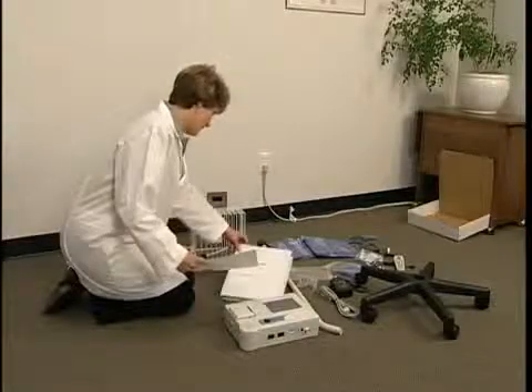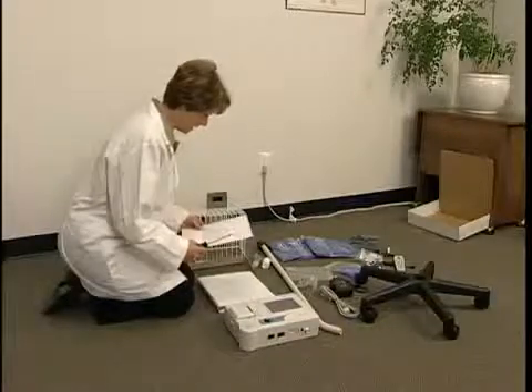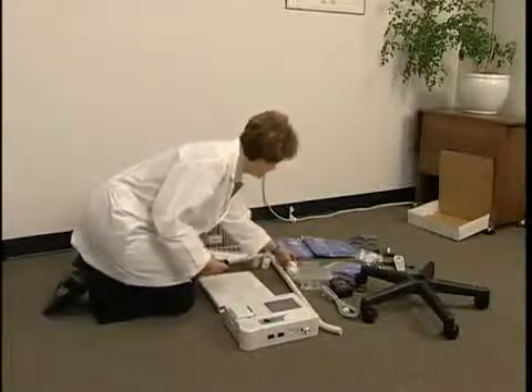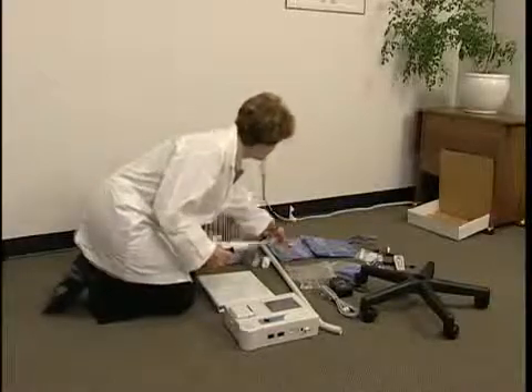After receiving the Vista AVS, unpack it and inspect for any external damage. Verify that you have received each of the contents listed on the accompanying packing list.